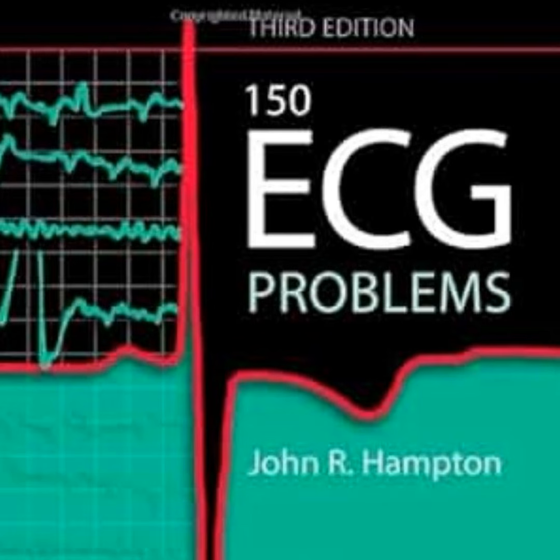It really highlights the progression of conduction system disease, and that leads us directly into the territory of the 3-star cases. The scary ones. Yeah, these are the critical precipice scenarios. So the text highlights a tracing showing a bifascicular block. Specifically, it's a right bundle branch block paired with a left posterior hemiblock. And Hampton flags this as a massive warning sign because it carries a really high risk of progressing to complete heart block. Complete electrical failure.